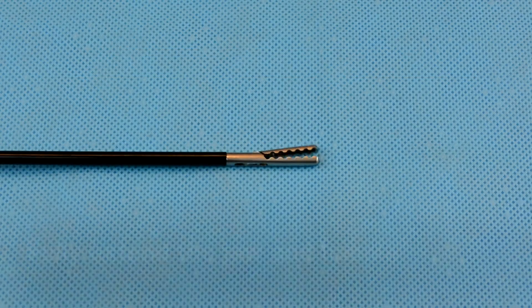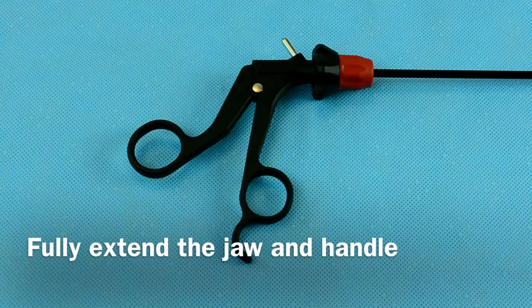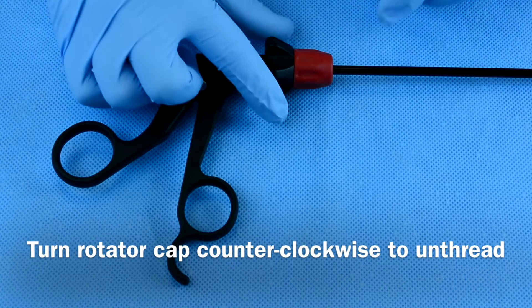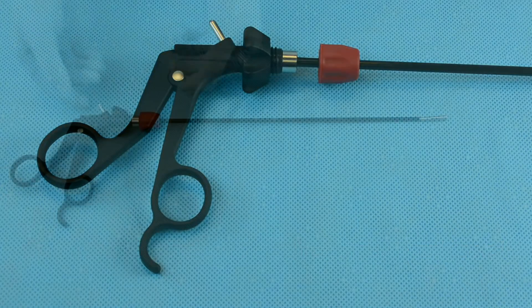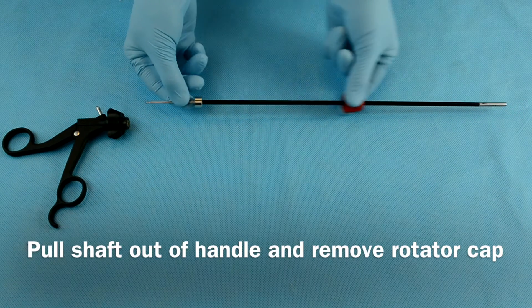To disassemble your precise instrument, first fully extend the jaw and the handle. Hold the rotator cap and turn it counter-clockwise to unthread the shaft. Then pull the shaft out of the handle and remove the rotator cap.